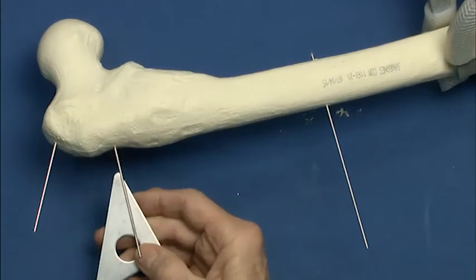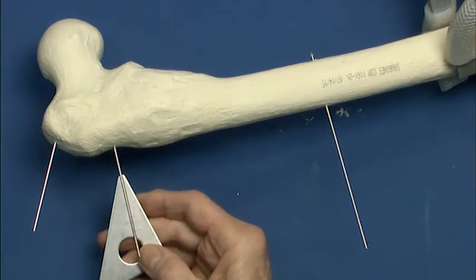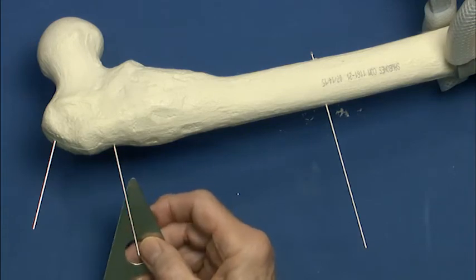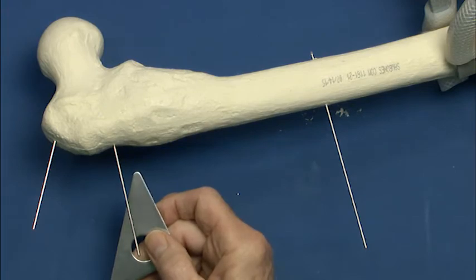Now, you can always talk about margins of error, and clearly if you're going to carry out a frontal plane correction from varus, if you're going to err, you'd like to go toward more correction than less. And this is always the situation that you're planning for. So I would overcorrect by 2 to 3 degrees if I was worried about the position of the seating chisel.